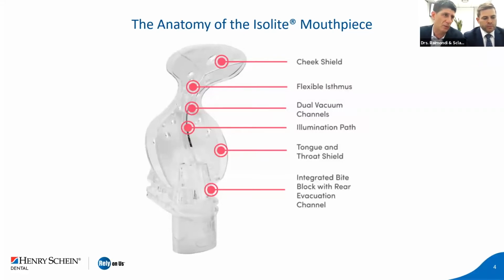As a prosthodontist, we both work with headlights. I have my overhead light. I have my light on my 2.5 magnification loops, and I still appreciate having the extra magnification and light, which trumps my headpiece. I can almost work without a light with this in place. You have 2.5? I use 2.5. I'm on 4. That's great. His vision is better than mine.